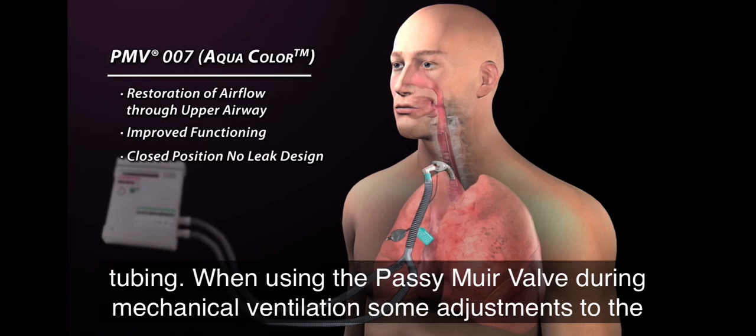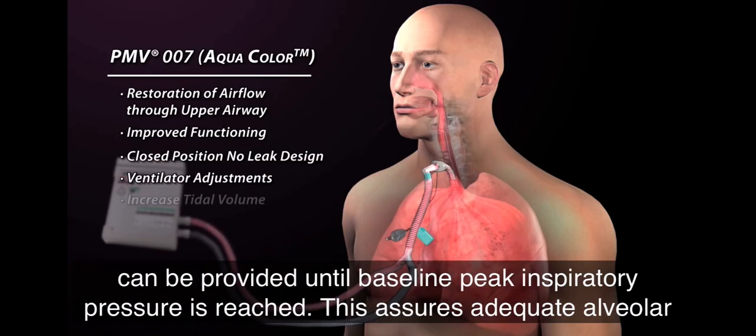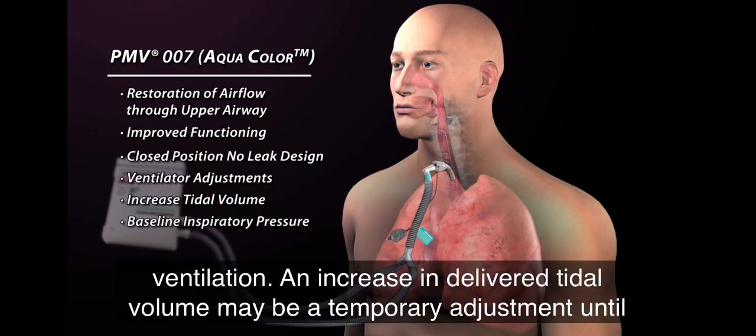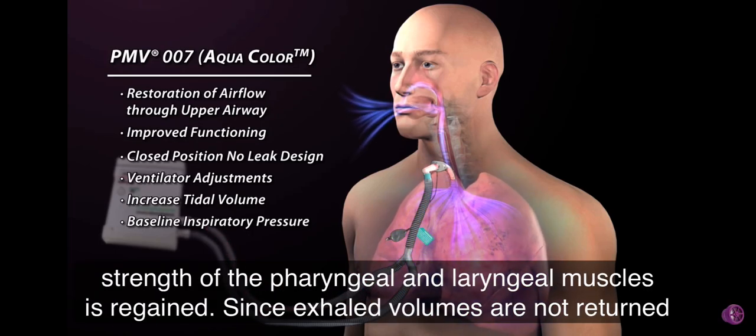When using the Passy Muir valve during mechanical ventilation, some adjustments to the ventilator may be necessary. For patients with inspiratory volume loss, additional tidal volume can be provided until baseline peak inspiratory pressure is reached. This assures adequate alveolar ventilation. An increase in delivered tidal volume may be a temporary adjustment until strength of the pharyngeal and laryngeal muscles is regained.